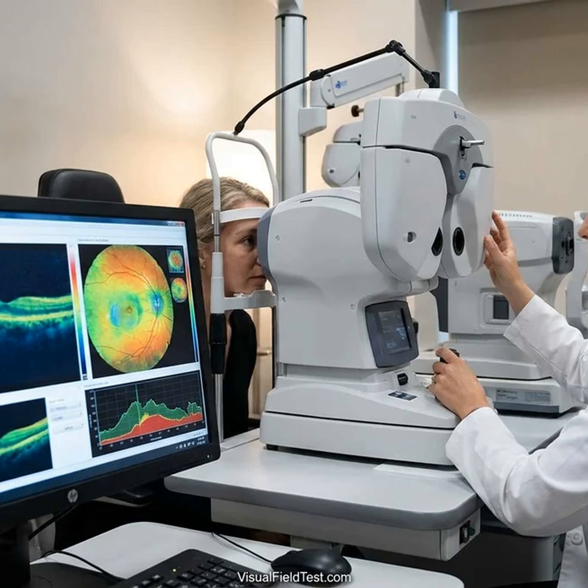Optic nerve head structure. OCT can image the back of the eye, the optic disc, directly. It measures features like the cup and disc sizes with metrics such as the rim area. A large cup or small rim can be a sign of glaucoma. However, OCT's advantage is mostly its precise thickness measures, not just the cup-disc ratio.